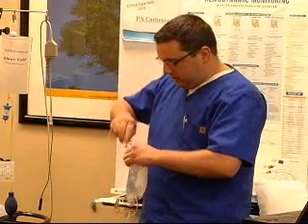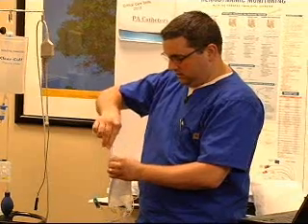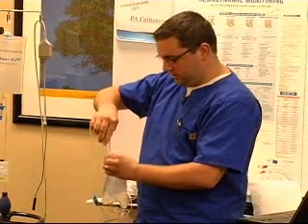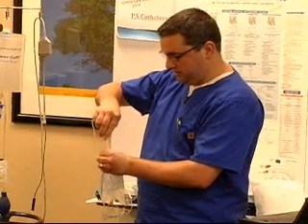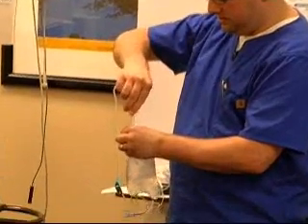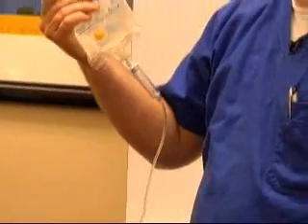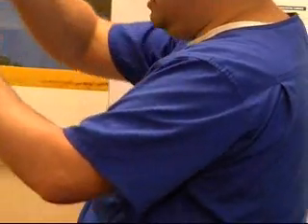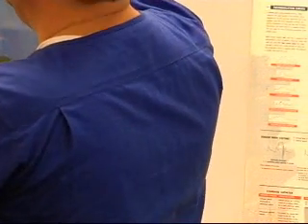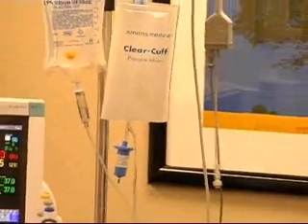Some people find that it's really easy just to pierce the insertion port right there just a little bit, and then just squeeze. If I can do it without making a mess, you just squeeze the bag, and then you can get a majority of your air out that way. So that's just another way of doing it. And you can also purge whatever's left in this chamber through the system whenever you go through here. Now you're going to be priming it with a gravity prime.